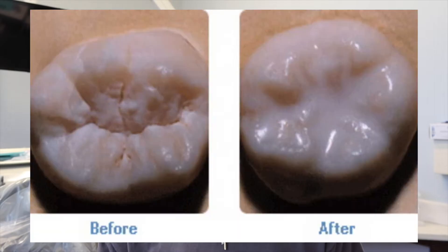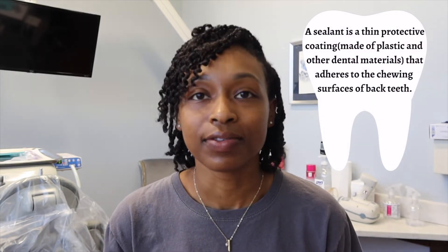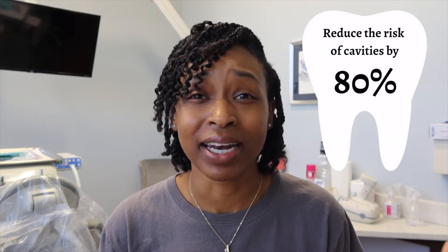Before we get going I just want to talk a little bit about what a dental sealant is and why I think they are effective for both children and adults. Brushing and flossing are the best ways to help prevent cavities, but it's impossible to get every nook and cranny clean on your teeth — especially those back teeth, your molars. A sealant is a thin protective coating made of plastic material and other dental materials that adheres to the chewing surfaces of your back teeth. Sealants have been shown to reduce the risk of decay by nearly 80 percent.